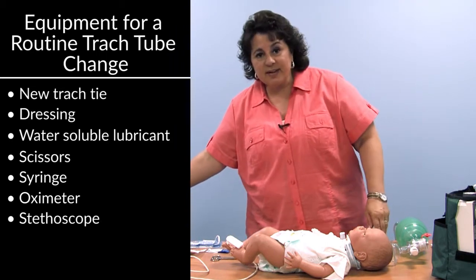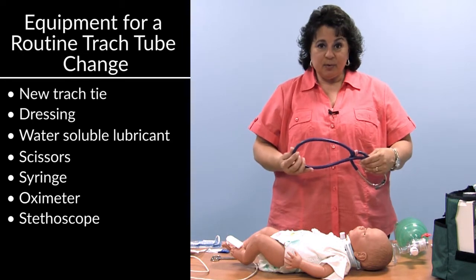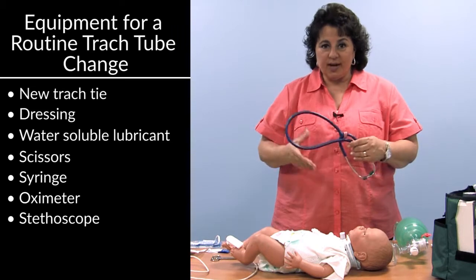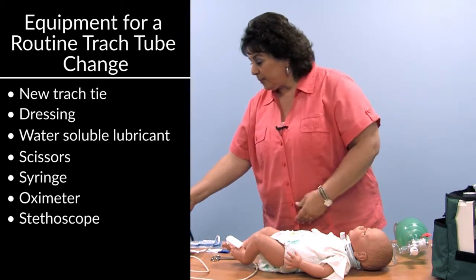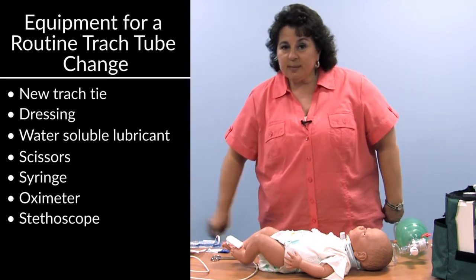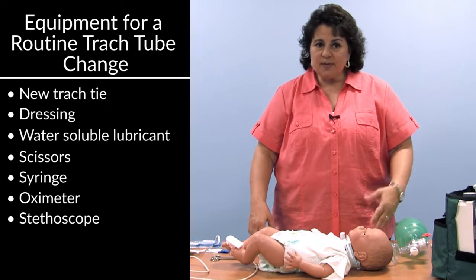We also have a stethoscope available so that we can listen to the child's lungs after we change the tracheostomy tube, to ensure that we hear air entry on both sides of the chest. You may or may not be prepared to use a stethoscope and listen. You will know your home oximeter and how it functions for you and how to look for a reading afterwards.